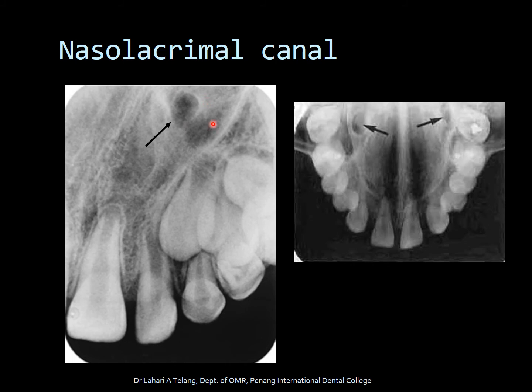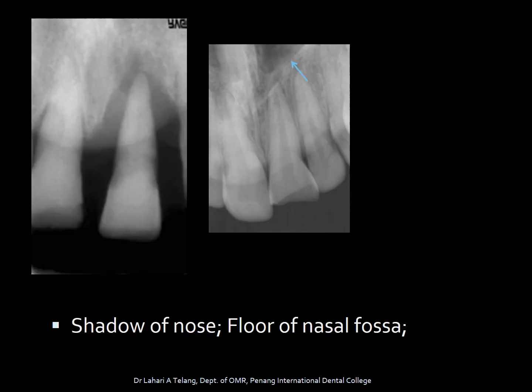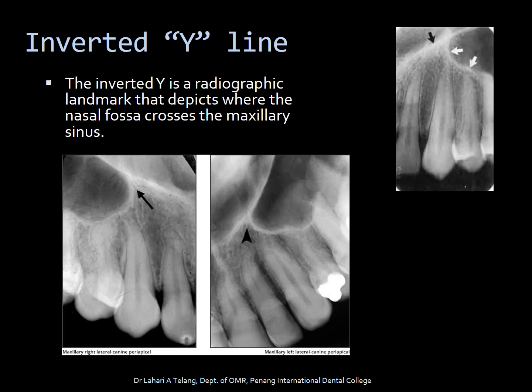The nasolacrimal canal is well-defined but very rarely seen on a canine radiograph; it is more clearly evident on the occlusal view. The shadow of the nose and the floor of the nasal cavity are also evident on some radiographs. Interestingly, you can also see the inverted Y line — a radiographic landmark depicting where the nasal fossa crosses the maxillary sinus. You can see the nasal fossa and the floor of the maxillary sinus crossing to give the appearance of an inverted Y.